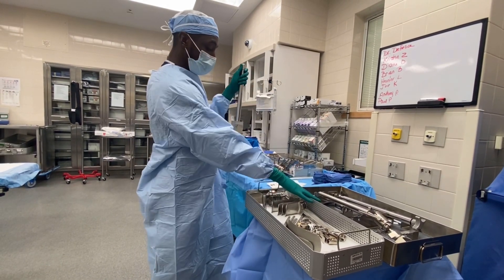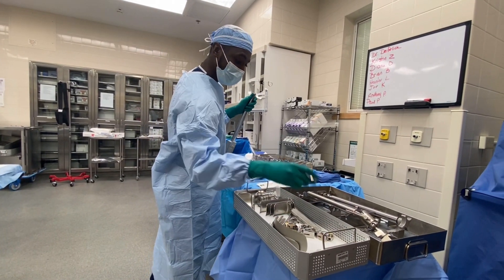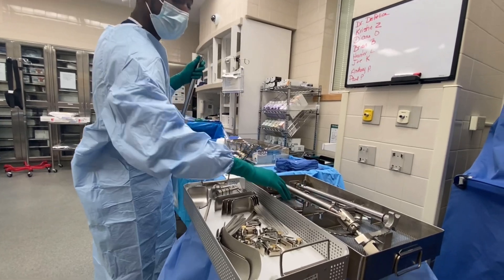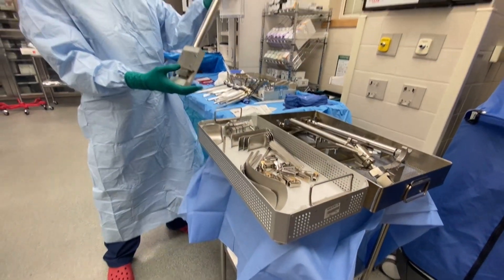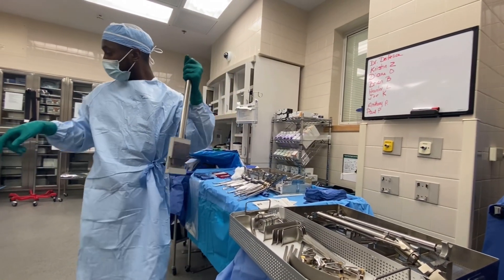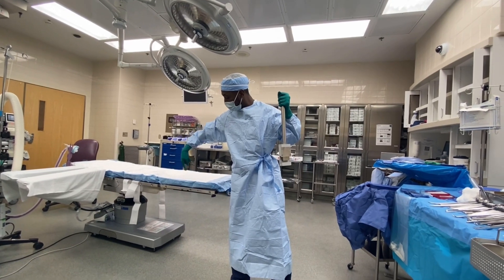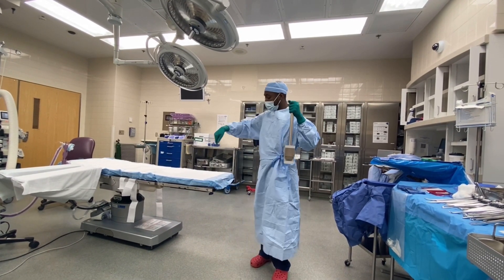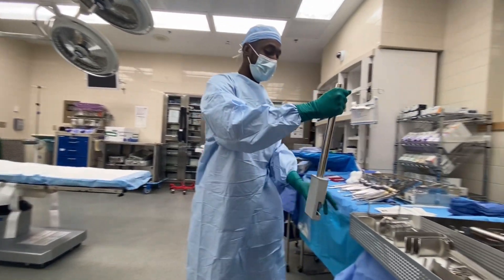We have two trays. The blades, ratchets, and couplers come in one tray, and the post and ring come in another. The first piece you're going to give to the doctor is the post, which hooks onto the OR table wherever they need it.